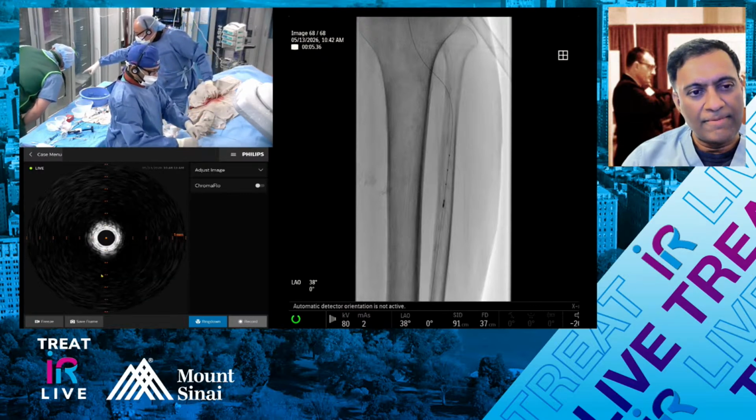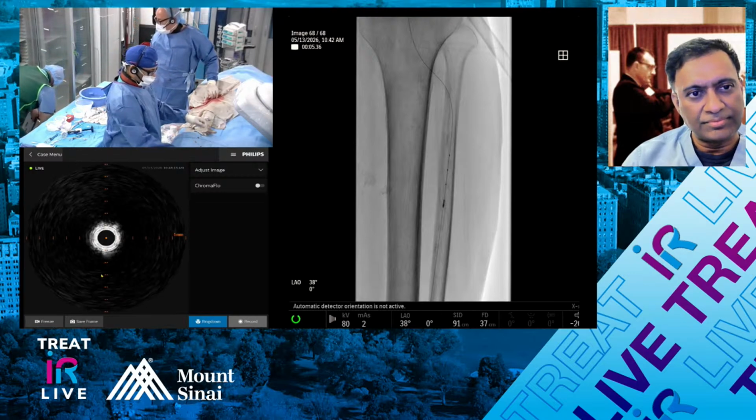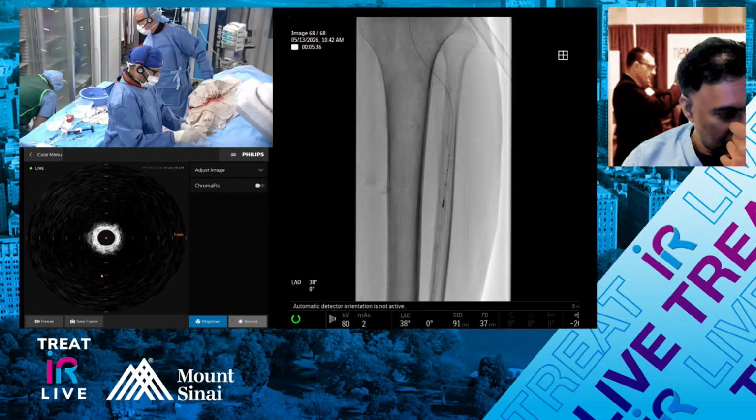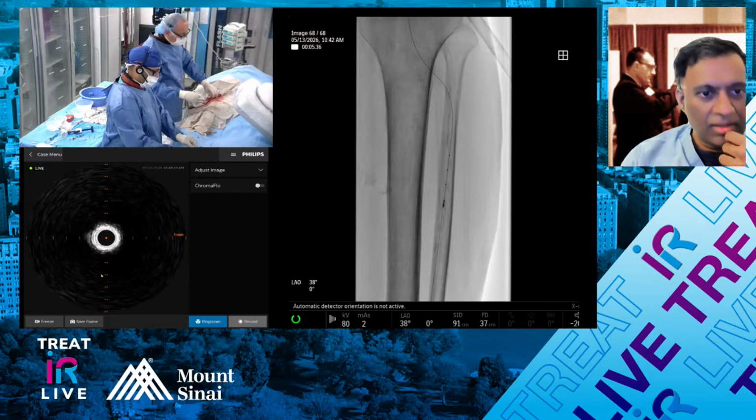I think they're on the second to bottom shelf. Yep, the 3.75 by 38. Can you open up two of those, please? Fabulous. I'm sorry, Joji. What was the question that you were asking me?